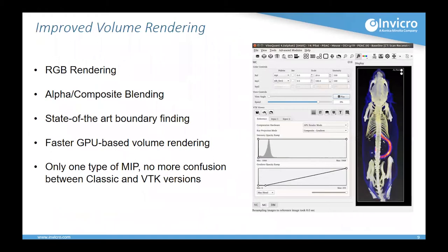A little on the maximum intensity projection. If you've seen it lately, there's quite a few more advanced tools that you can use. For one, you can save dynamic movies of it now. If you have a dynamic image, you can export a nice movie for your presentation where the particular angle you have scrolls through the frames of your image.